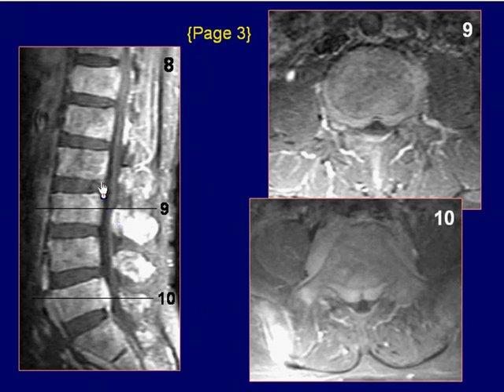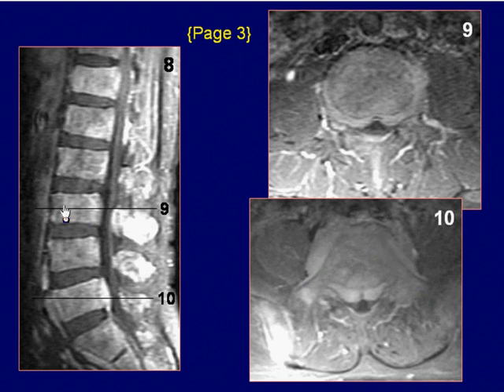These are sagittal and axial post-GAD fat saturation T1-weighted images of the lumbar spine, demonstrating similar enhancing lesions.